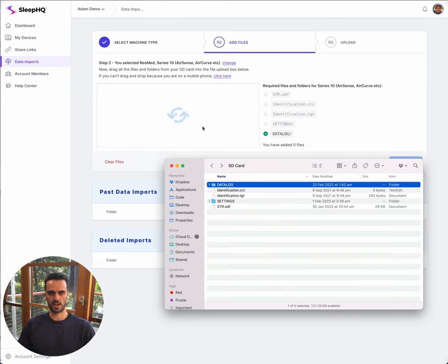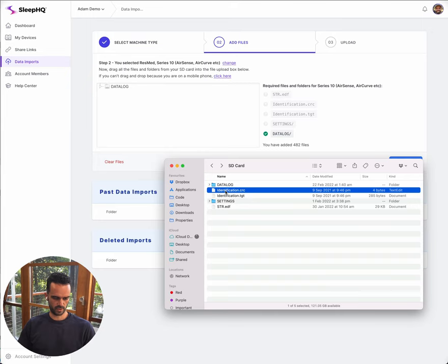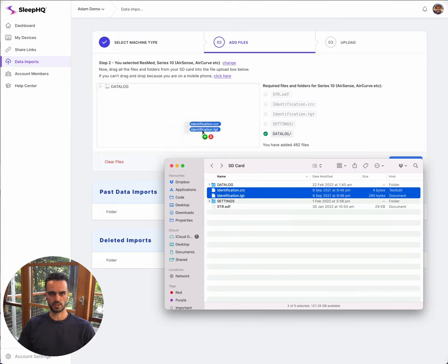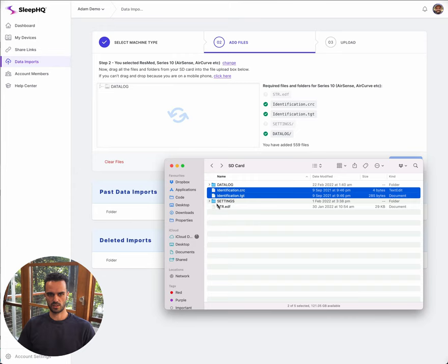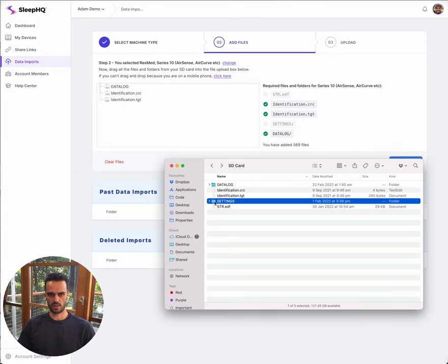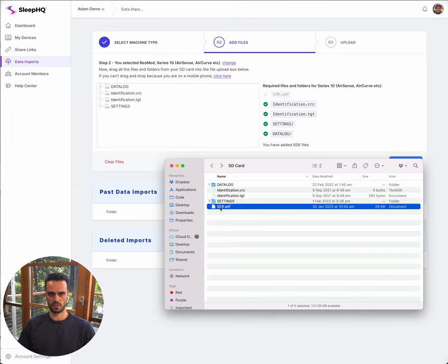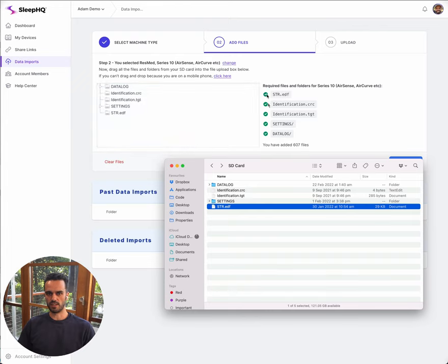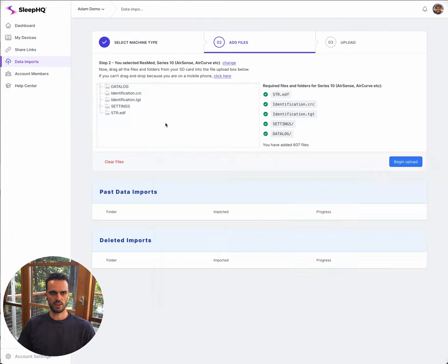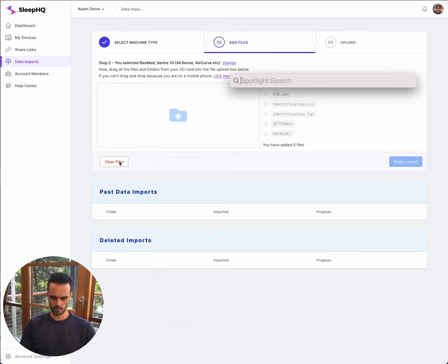Just to show you how that works, I'm going to add everything one at a time. I'm going to drag in my datalog folder and you can see that's now been checked off. Then we've got these two different identification files. I'm going to drag both of them in and you can see they're both checked off. We've got our settings folder and also an str.edf file, and so everything is now checked off there.